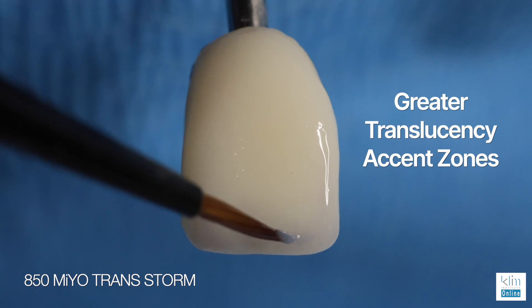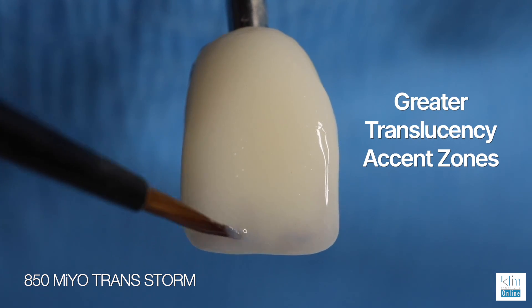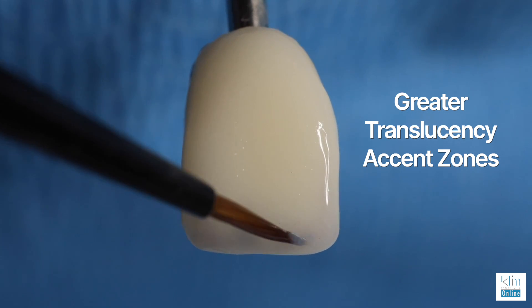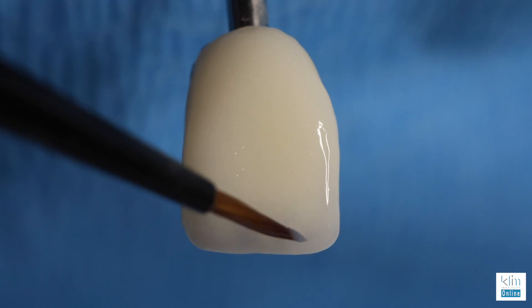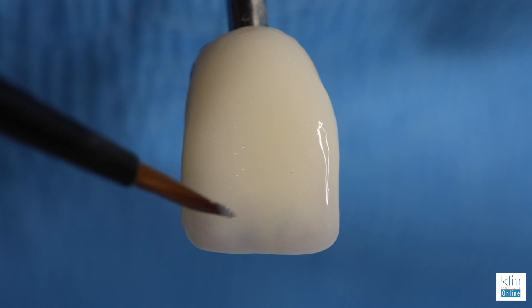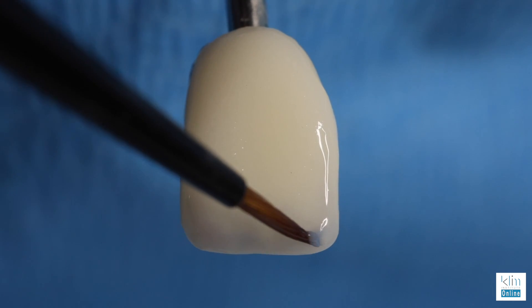Storm is a great complement to smoke. Use it to add translucency accent zones, such as at the incisal edge of the primary depressions and often around the line angles. Float on the color and blend it in with the smoke. You'll see a little more emphasis just in those areas that we want to pop a little more translucency illusion.